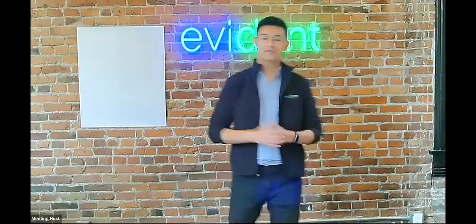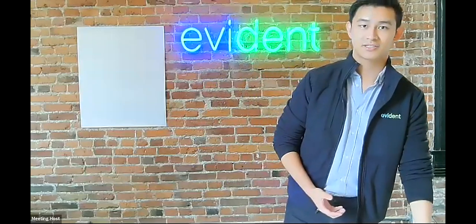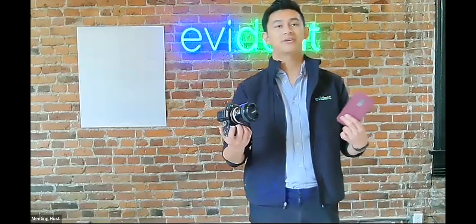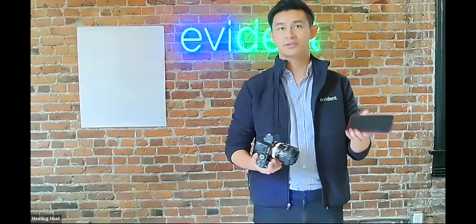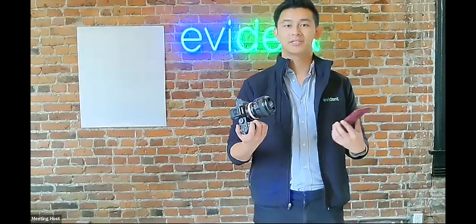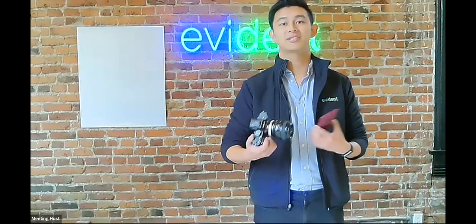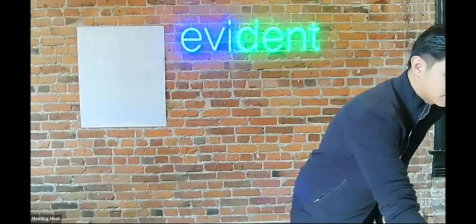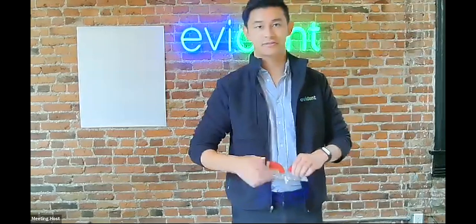First off, I'll run through a few of the things that you'll need to get started. You'll need a device to take some photos. That could either be a smartphone, as long as it has a camera, or you can use a professional camera. Here I have an Android. You can also use an iPhone, but I also have here a Sony mirrorless camera, though DSLRs work great too.